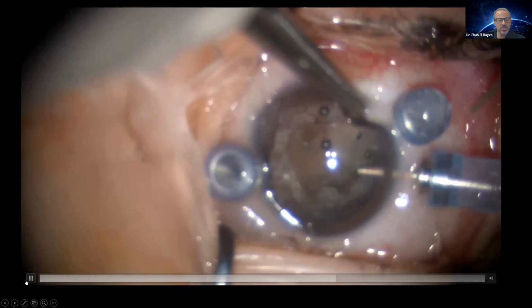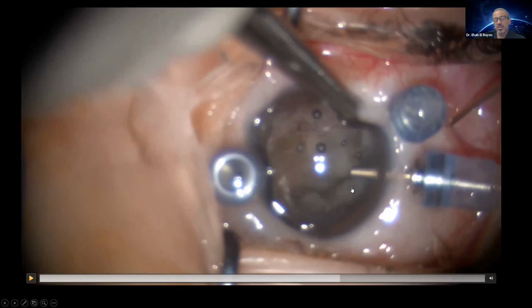When you see these patients sometimes in the clinic, you say, well, they're maybe not operable, or what's the child's benefit? This is a case of stage 5, which I was doing the dissection, and here after I remove much of the fibrovascular proliferation, I'm aspirating the subretinal blood by a needle. You can see it right behind the trocars. This is active aspiration. This helps the retina to start opening and settling up, and it decreases the time for the subretinal fluid to resorb.